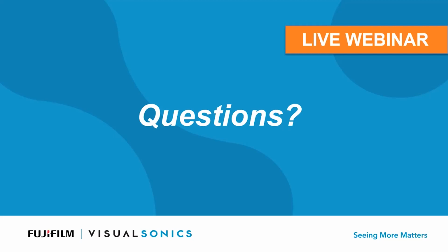Okay, great. And the next question, what is the resolution needed to observe a significant difference in the liver texture? I don't fully get this. So you mean the frequency? He's asking about the frequency? Yeah, I mean frequency, which lends to resolution, I assume. So the frequency we use is about 21 megahertz, right? This is designed for that. And for the photoacoustic imaging, we use a 9 to 18 megahertz broadband transducer. With this frequency, we get high spatial resolution.